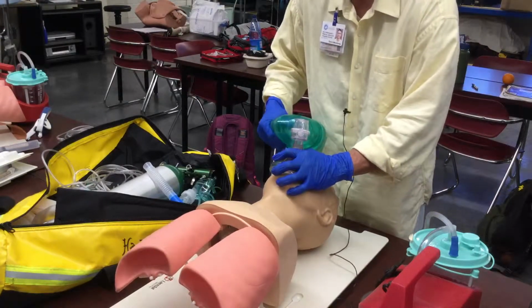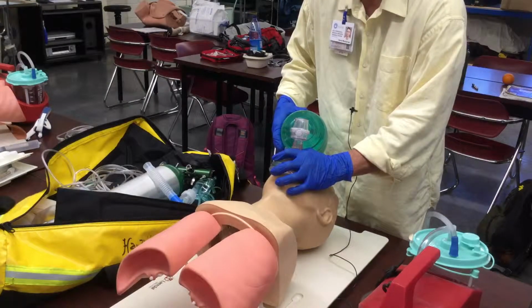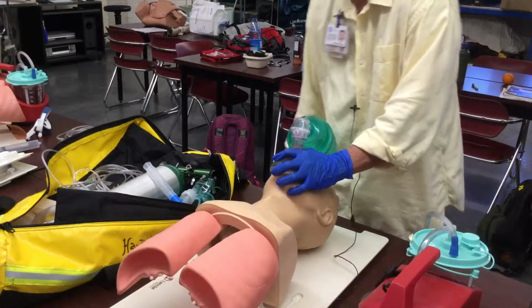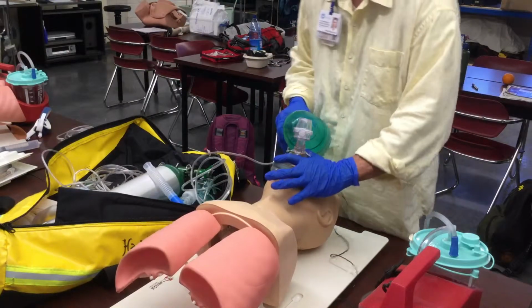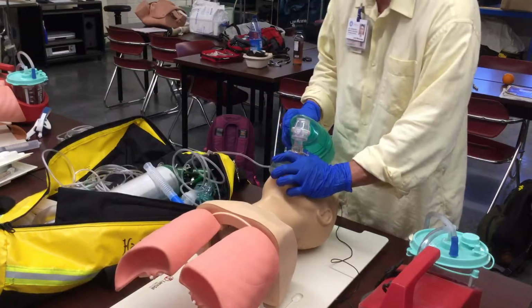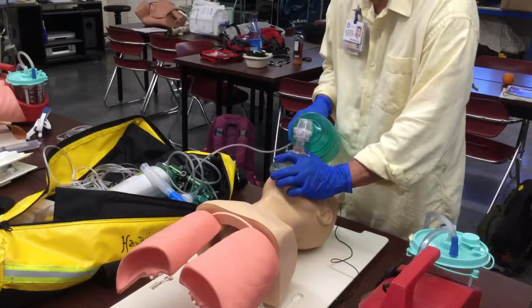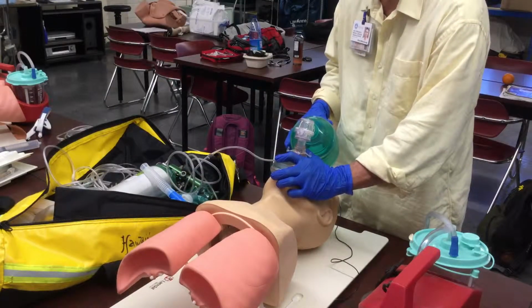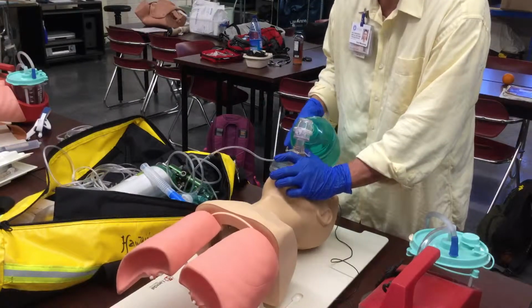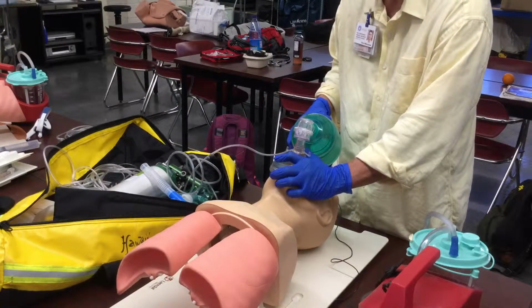So I give one breath every 5 to 6 seconds, 10 breaths per minute, to see adequate rise and fall. Now that I have adequate rise and fall, I can go ahead and connect up my oxygen tubing to the regulator and set it to high flow, 15 liters. Go ahead and make sure that I have a pulse and that the patient is still breathing and has a pulse.